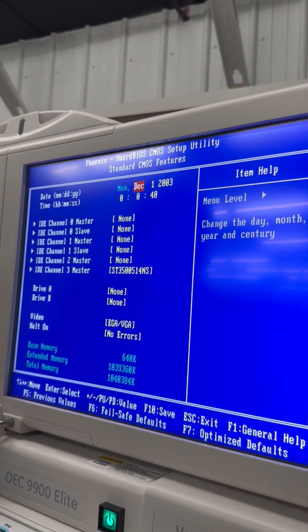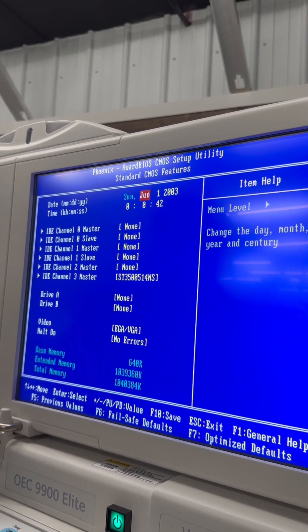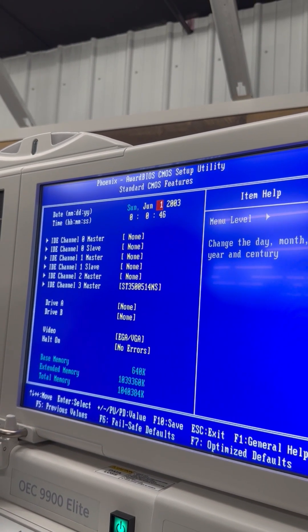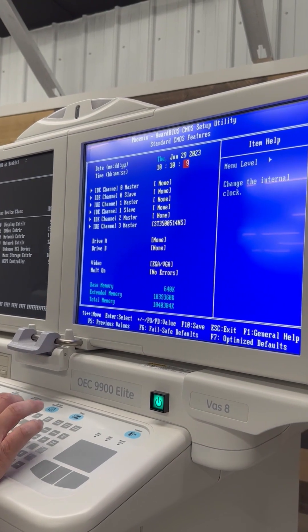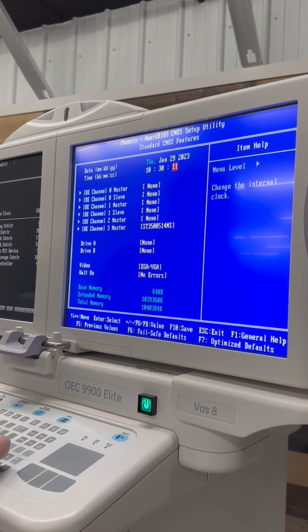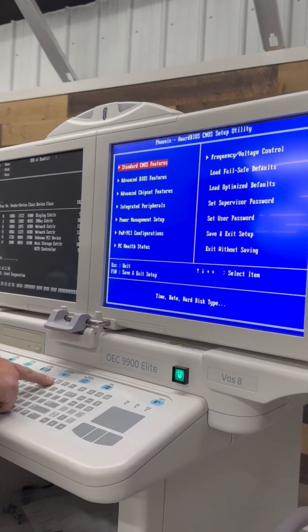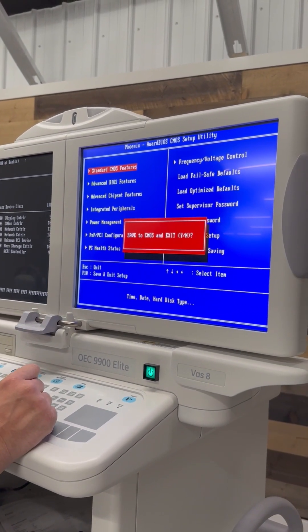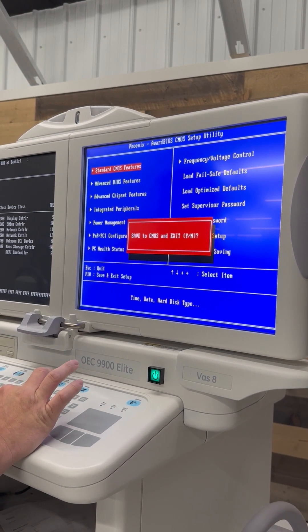Just to verify, we'll go back up to standard CMOS features and make sure that the date is correct. It's not in this case, so we will hit the page up button to change our date. Then we'll hit escape to get out of this menu, and then hit F10 on the keyboard to save. We will hit yes and then hit enter.